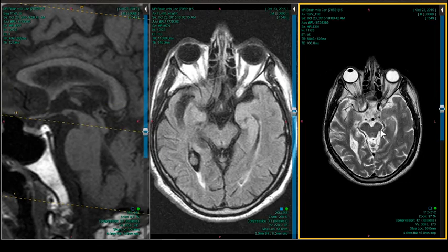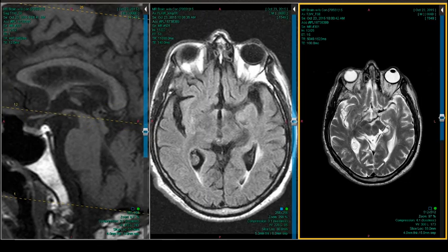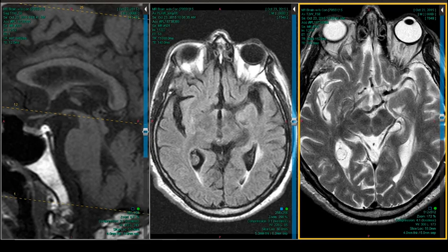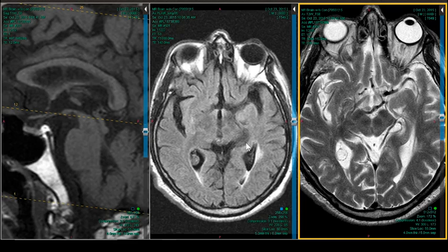So you have to get these implanted in your mind and say, wait a second, going through your axials, then you start looking at the sagittal. Dr. Pomerantz mentioned the coronal is important to look at the hippocampi and entorhinal cortices. Sagittal is important for all these midbrain multi-system atrophy things, and then the midbrain iron. I have to be intellectually honest. In the younger and mid phase of my career, I wouldn't have appreciated that this was atrophic without the sagittal.